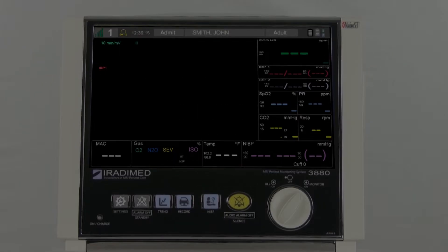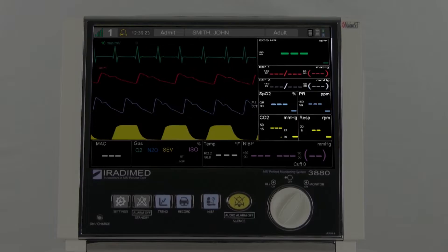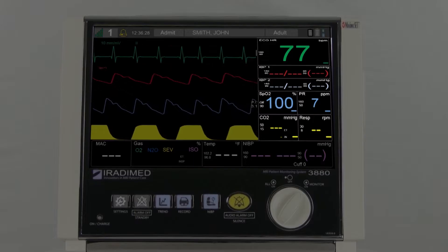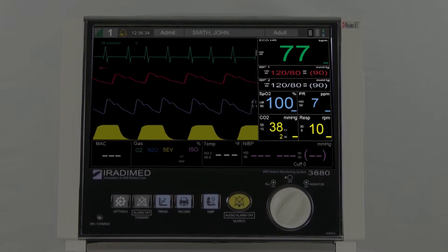In the center section, the user will see the color-coded waveforms for ECG, SpO2, CO2, and when activated, the invasive blood pressure. On the right side of the screen, the user will see various sections for ECG, SpO2, pulse rate, CO2, respiratory readings, and when activated, the invasive blood pressure.